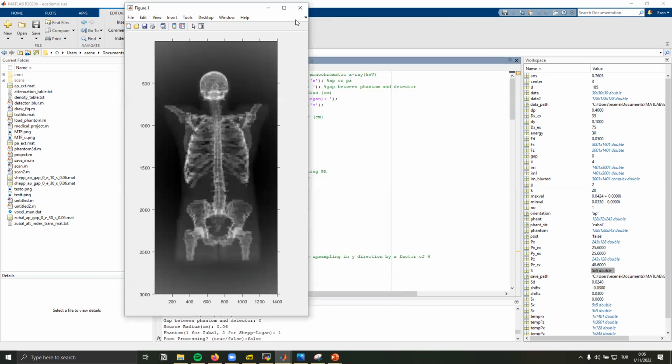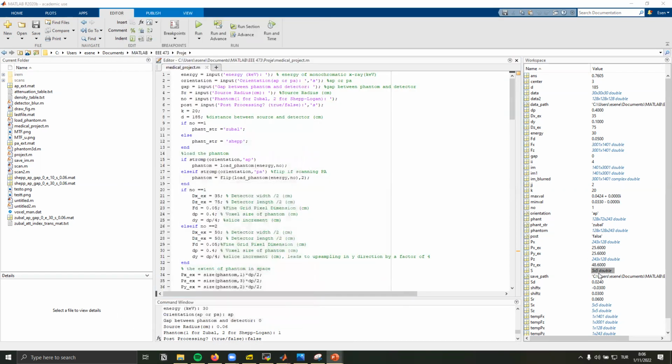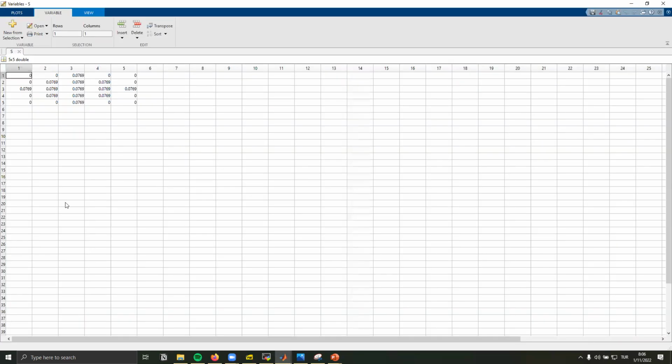And to simulate the extended source, we have, again, as my friend said, acted like it was a combination of point sources. And here we see that for each of these point sources, we simulate an imaging process, and then we add all of those effects to simulate an extended source.